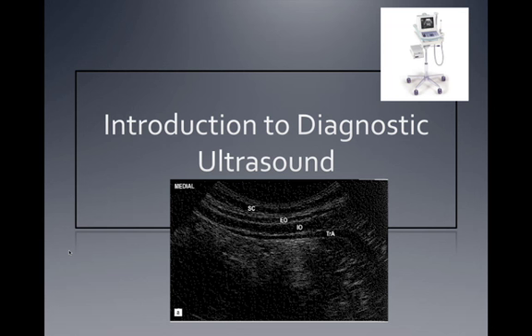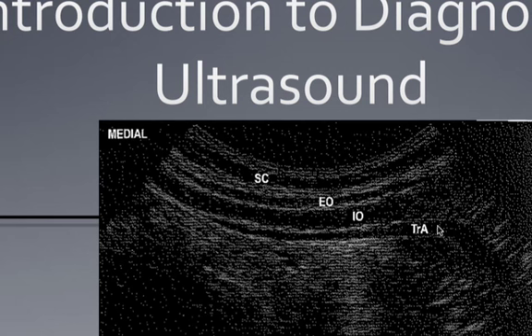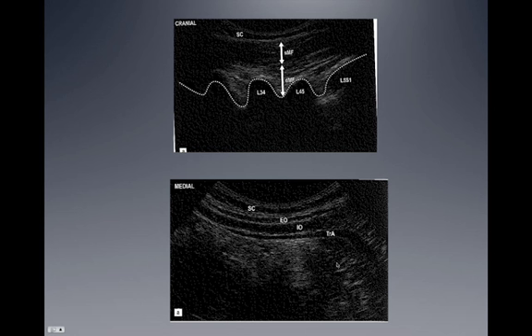This is one of the things that you are going to learn how to produce by the end of this part of instruction. You should become very familiar with this, and this is what you're going to be looking for when we're looking to train and look at the transverse abdominis, which is what is shown right here: TrA, transverse abdominis, internal oblique and external oblique. Okay. So again, we see that same shot.